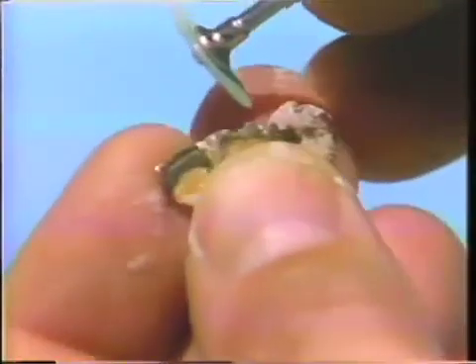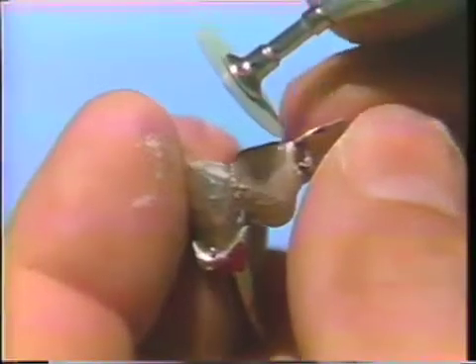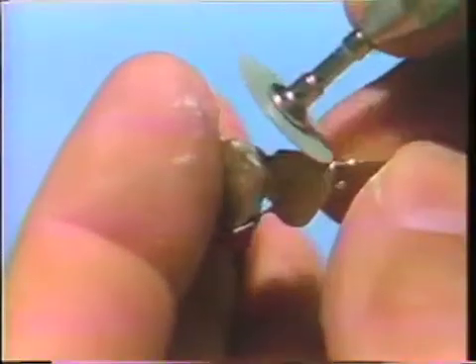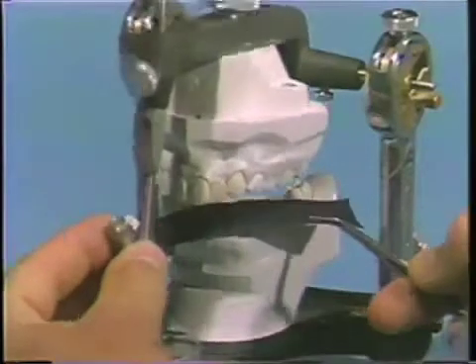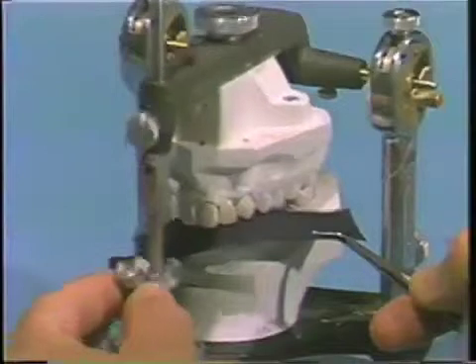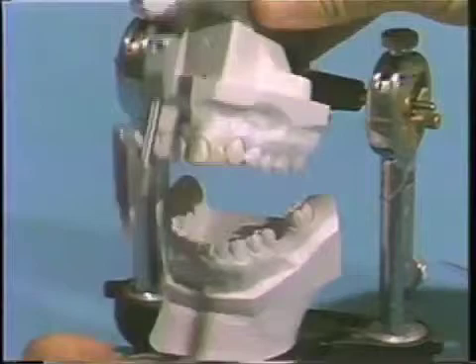The same disc is then used to modify the incisal edge going from gold to porcelain. This margin should be smooth and there should be no catches as you run an explorer from porcelain to gold. The bridge is then tried back on the model and if the occlusion is correct, then we are ready to cement.